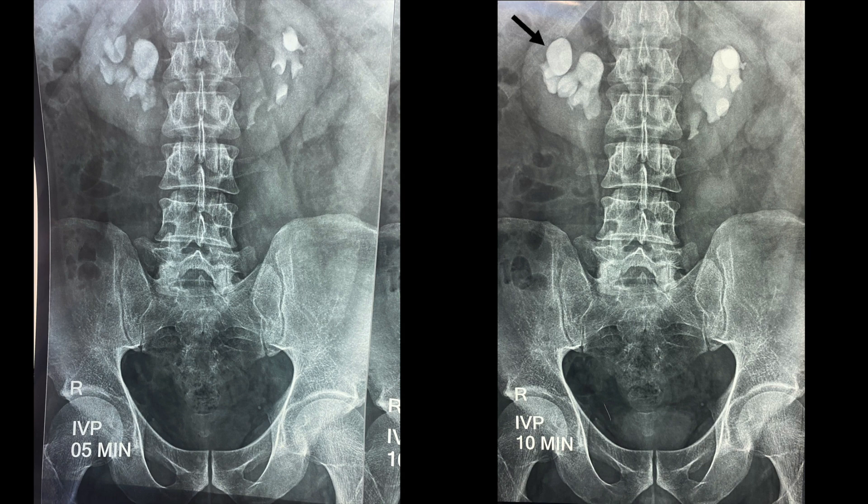Generally the medially located calyces are the posterior calyces, so this calyx will be an ideal calyx for us to puncture — to enter the straight and shortest path to the kidney and reach the stone in the pelvis easily. This calyx will also help you to reach the inferior calyx as well.